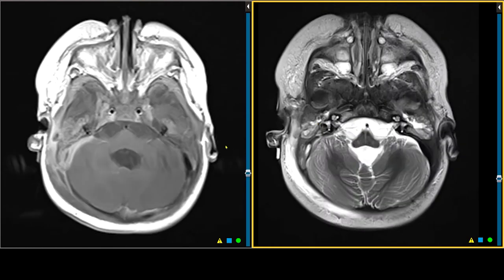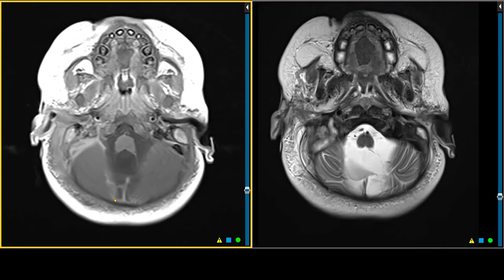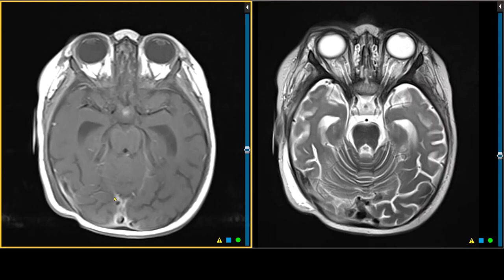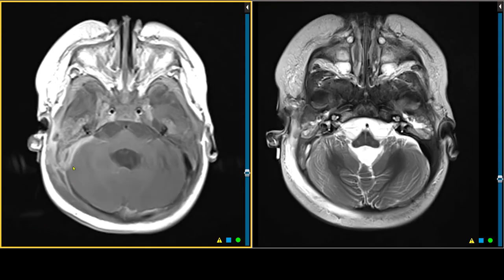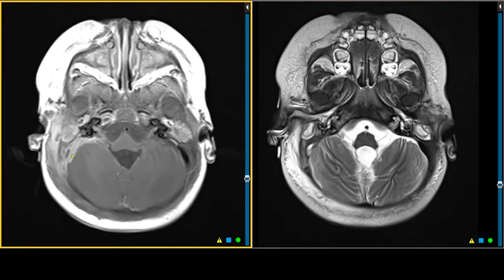On the post-gadolinium enhanced scan, you get a sense that the patient has meningeal enhancement in the posterior fossa, which is rather striking. And where one would expect to see the sigmoid sinus and distal transverse sinus, instead we see enhancing tissue.